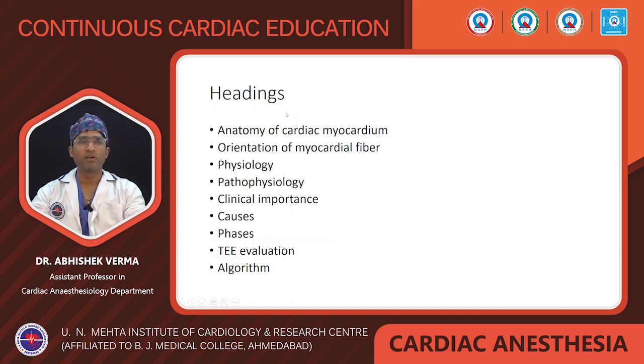I divide my topic into the following heads: anatomy, orientation of the myocardial fibers, physiology, pathophysiology, clinical importance, causes, phases of the diastole and the TE evaluation, and lastly the algorithm of diastolic dysfunction to diagnose.